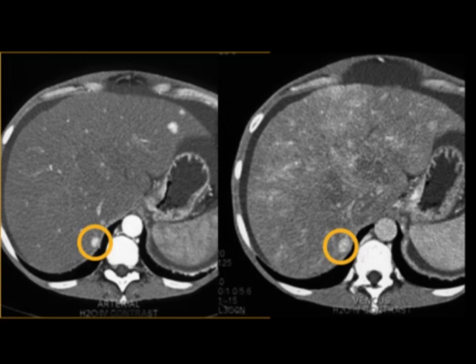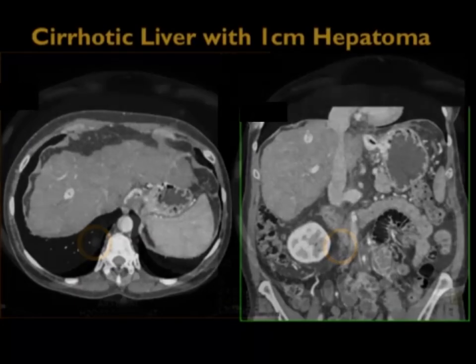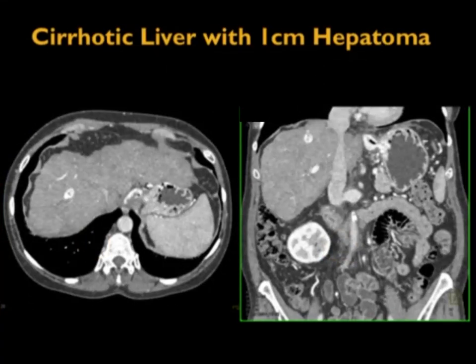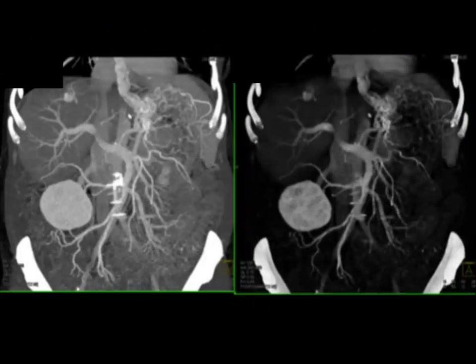Regenerating nodules are a challenge. Sometimes MR can be helpful. This patient has cirrhosis and there's a one centimeter lesion in the dome of the right lobe of the liver, but that's a hepatoma. With regenerating nodules, we don't see any neovascularity. In this case, you can see the neovascularity feeding this lesion that's seen in the dome of the liver.